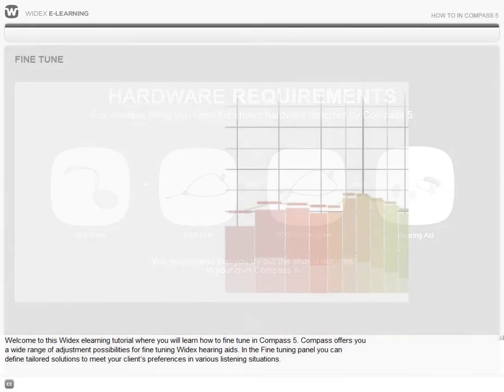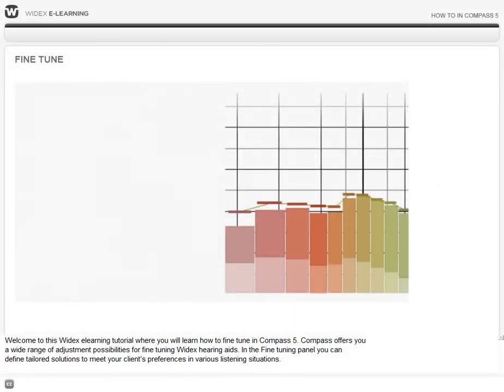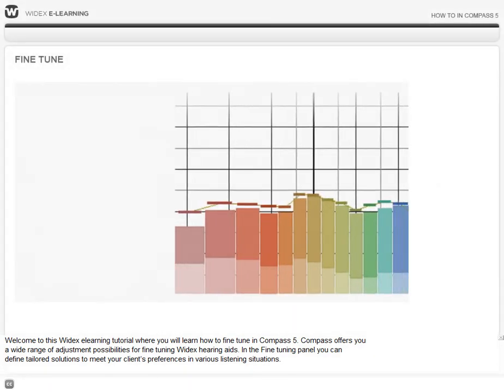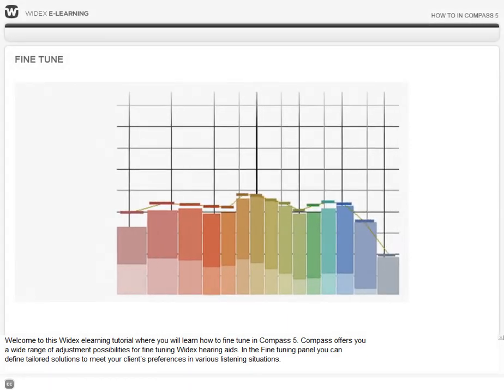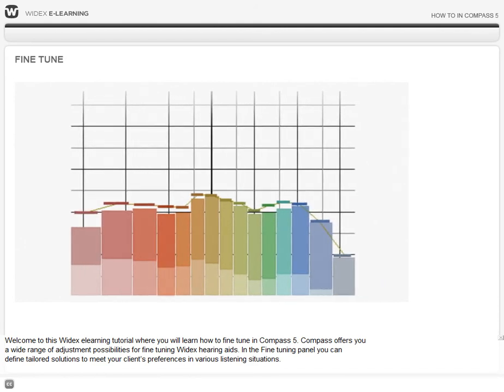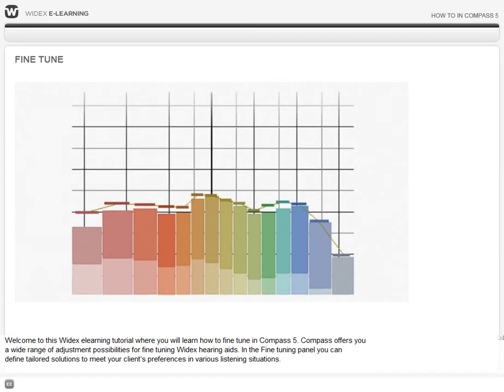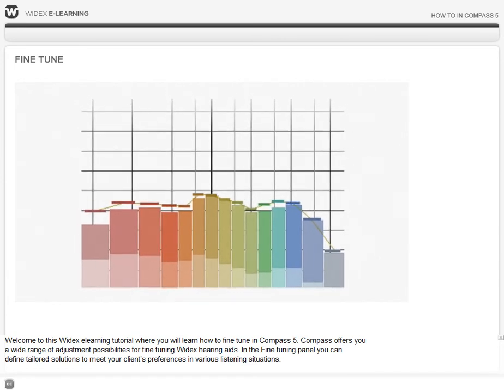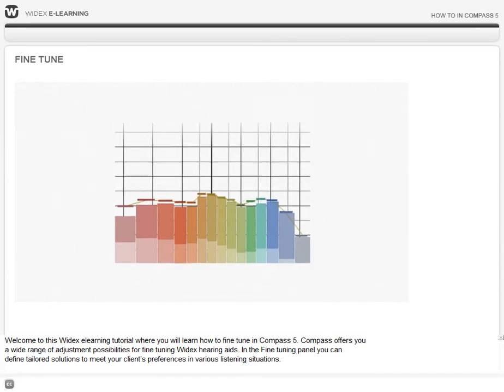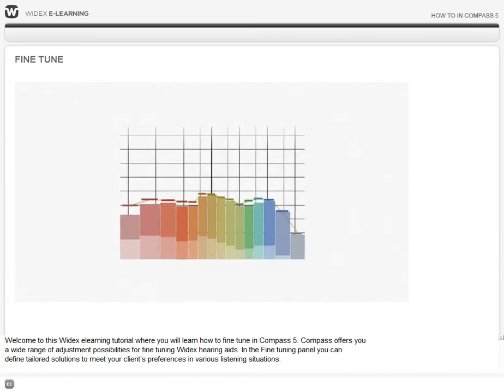Welcome to this Widex eLearning tutorial, where you will learn how to fine-tune in Compass 5. Compass offers you a wide range of adjustment possibilities for fine-tuning Widex hearing aids. In the fine-tuning panel, you can define tailored solutions to meet your client's preferences in various listening situations.